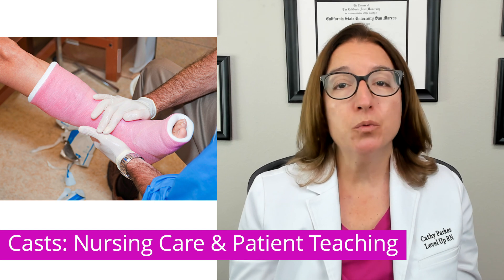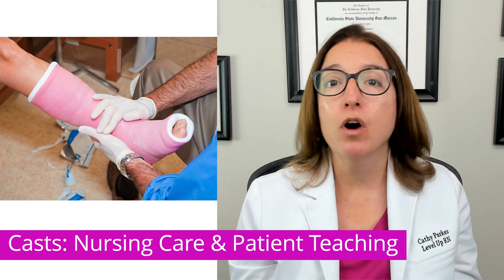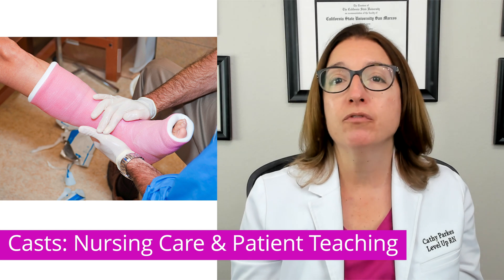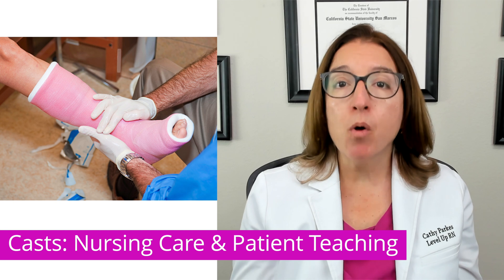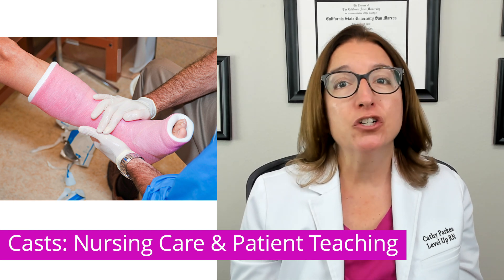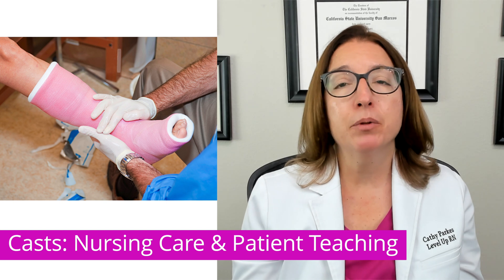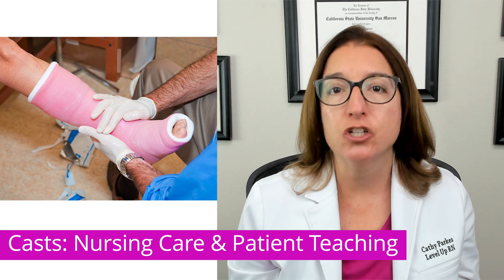First, you want to elevate the cast and apply ice for the first 24 hours. You want to handle the cast with your palms and not your fingertips in order to prevent denting until the cast is dry. Your patient can use moleskin around any rough edges of the cast, and you should advise your patient to never insert objects into the cast. If they have itching, they can blow cool air from a hairdryer inside the cast to relieve that itching.